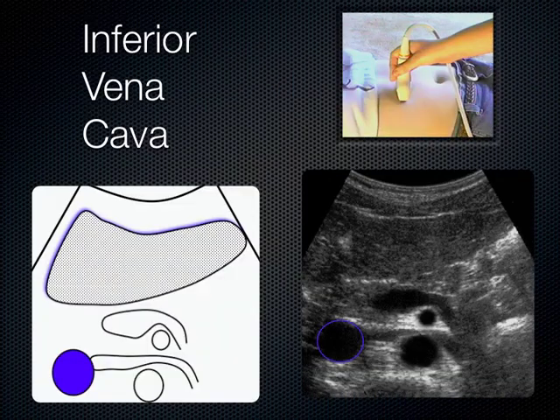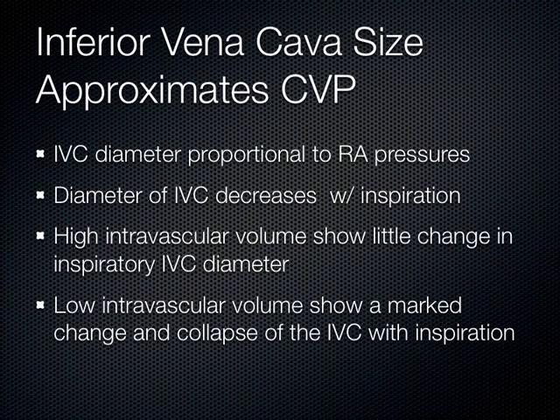Okay. One more time with the anatomy then. What's this? Good. What's this? What's this? What's crawling over SMA? Splenic vein, very good. What's this tissue out here? Pancreas. Liver. And what's getting nut cracked here? Left renal vein dumping into the IVC. Very good. Okay. Cool? Now let's talk more about the IVC.